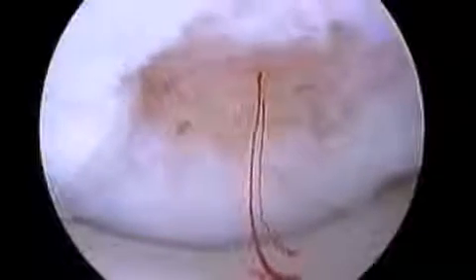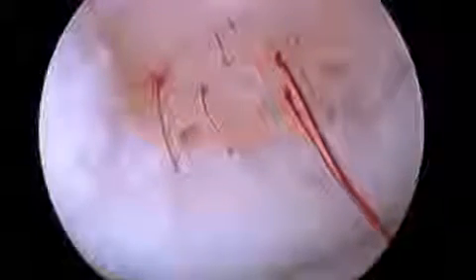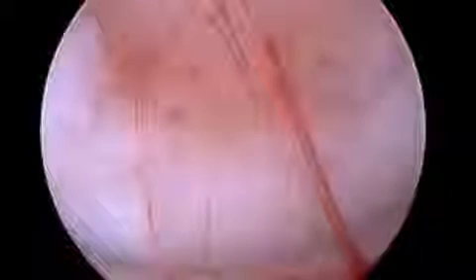Once the tourniquet has been released, we're able to visualize the bone marrow elements flowing from the microfracture events. This allows the body to potentially heal and create a hyaline-like fibrocartilage cap over the chondral defect.